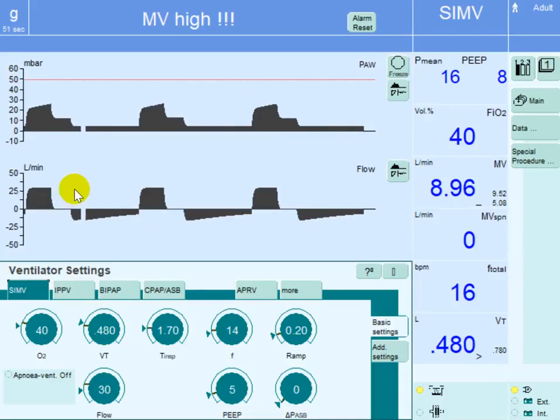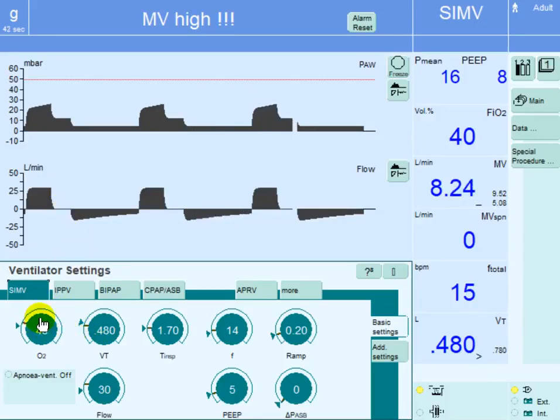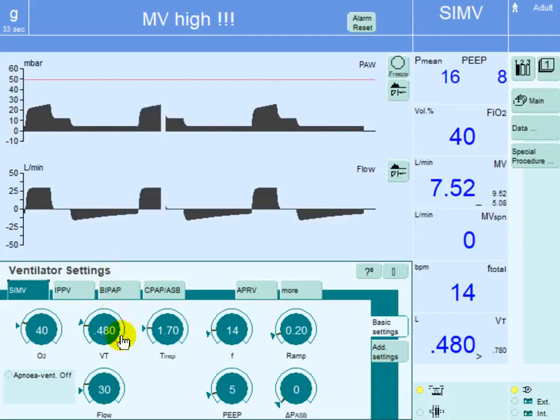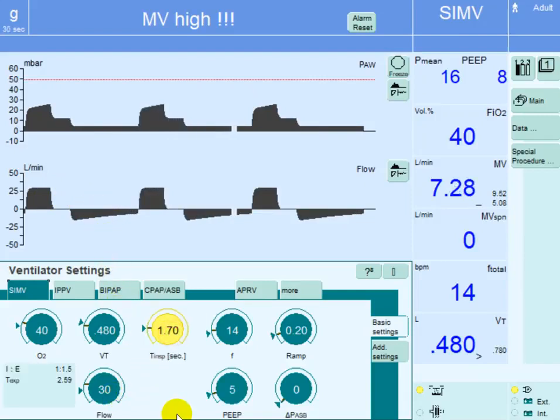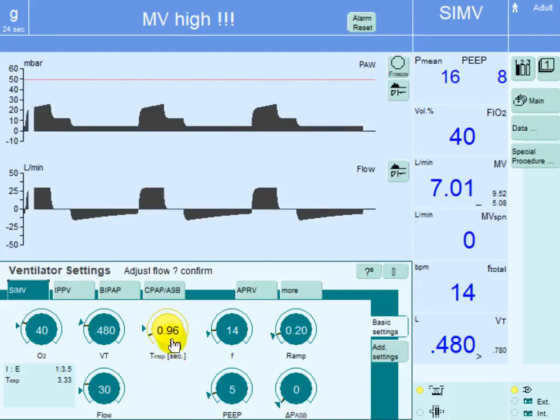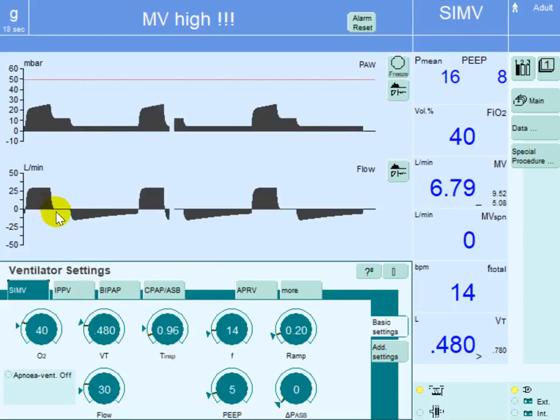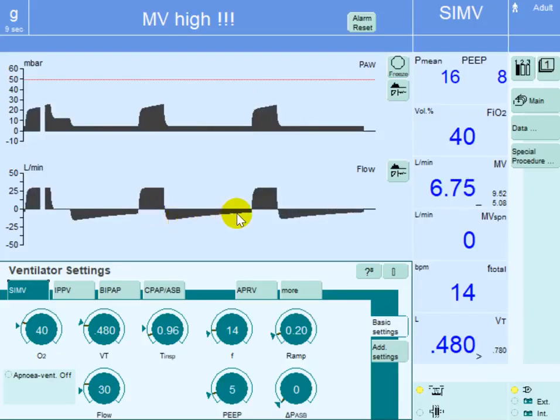At the same time, if you look at the expiration, you can see there is a plateau that is not required. This patient has no problem with oxygenation, and I would rather use this time for expiration. So let's eliminate the plateau time and add it to expiration. The way we eliminate it is by going down on the inspiratory time — down to the minimum required for this tidal volume to be delivered. By doing this, you can see that we've eliminated the plateau completely, and the expiratory flow is improved.